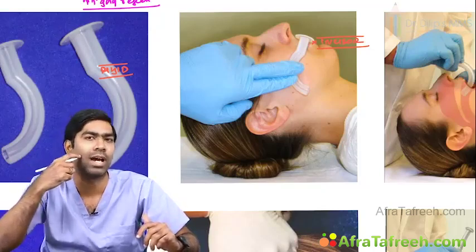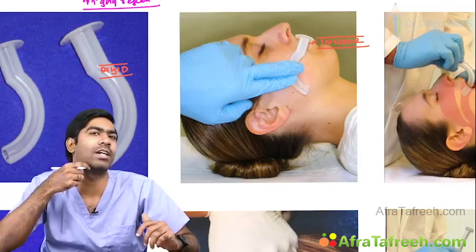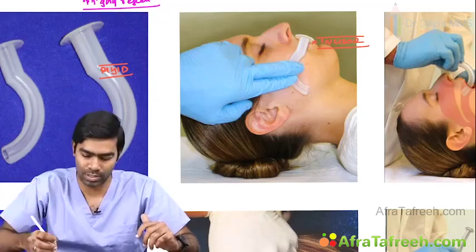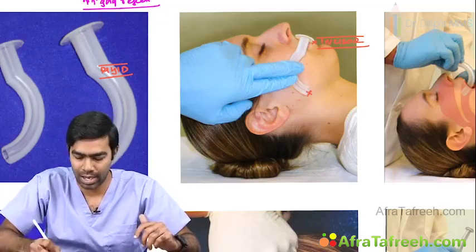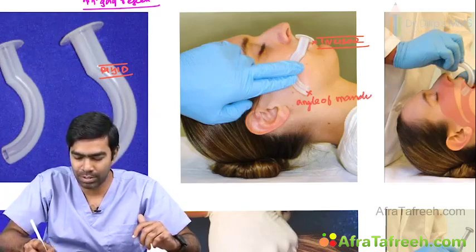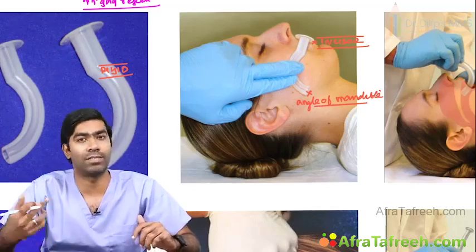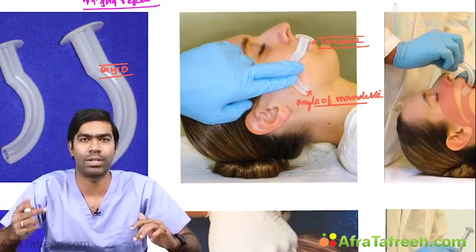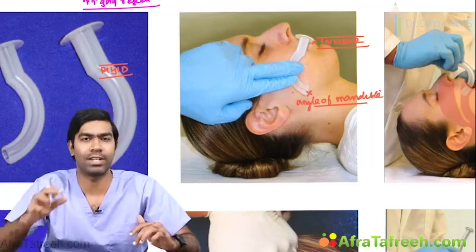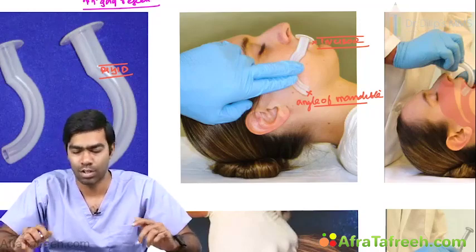So you keep the airway beginning here, and you place it vertically down so that the airway reaches the angle of the mandible. You can see the airway here reaches the angle of the mandible. So this is the right size of the airway for the particular patient. Suppose it crosses the angle of the mandible and goes beyond, then it's a very big airway, not suitable for the patient. If it's very small so that it doesn't reach the angle of the mandible at all, again it's a very small airway, not good for the patient. So this is how you select the size of the oropharyngeal airway.